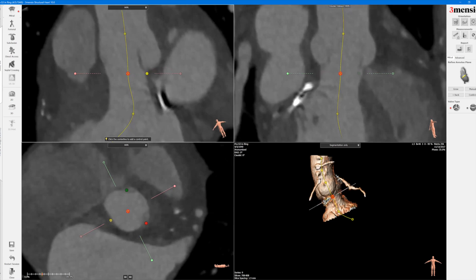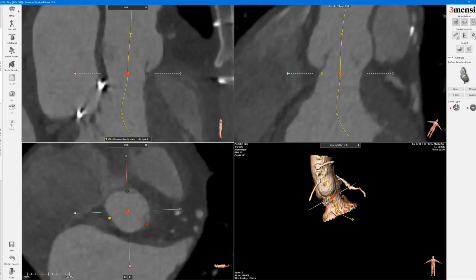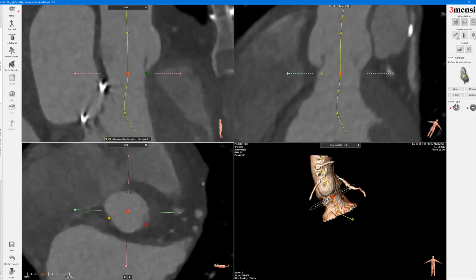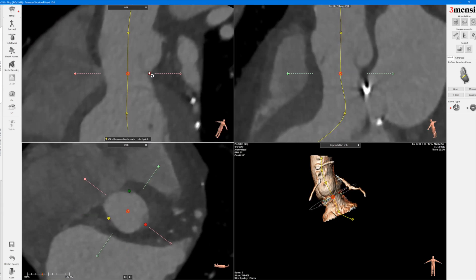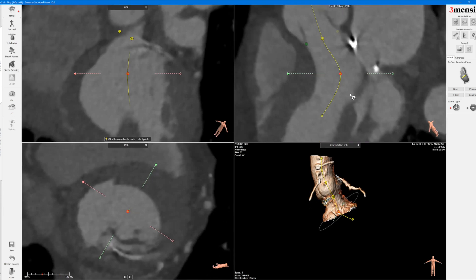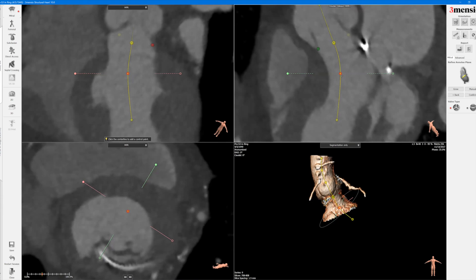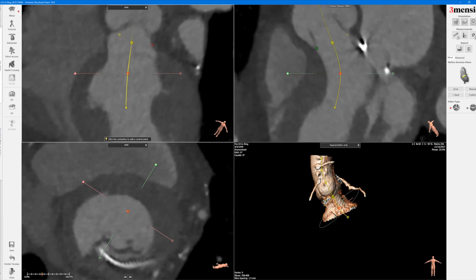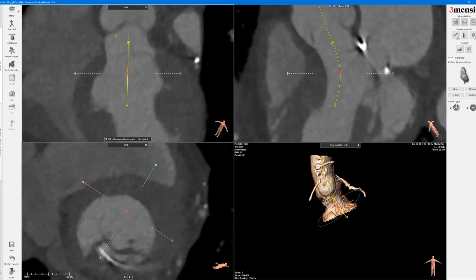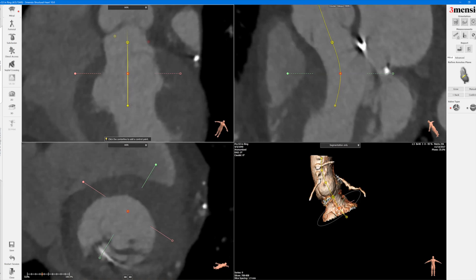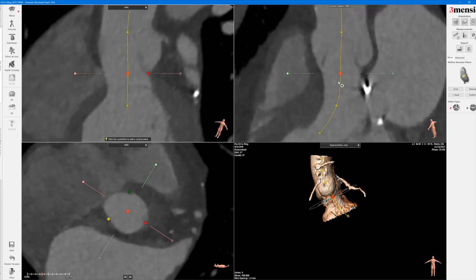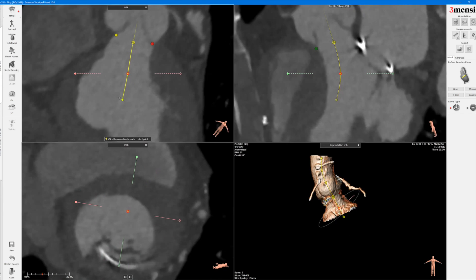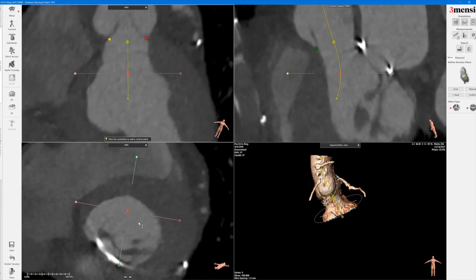Now you just fine-tune to make sure you're exactly in the middle — click on the dot directly, go up and down. This one needs to move a little bit clockwise, and you can see the red dot here looks pretty good, maybe a little counterclockwise. Then you need to make sure you have your new LVOT by putting the new LVOT centerline appropriately along the interventricular septum. On the perpendicular view, make sure you're in the centerline of the ventricle — you can see how I center this into the ventricular cavity.